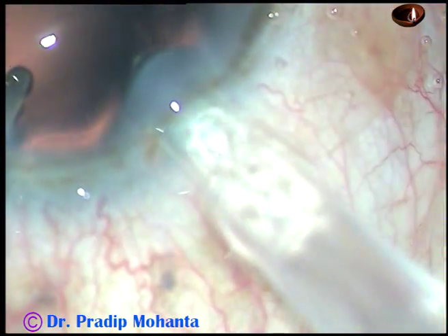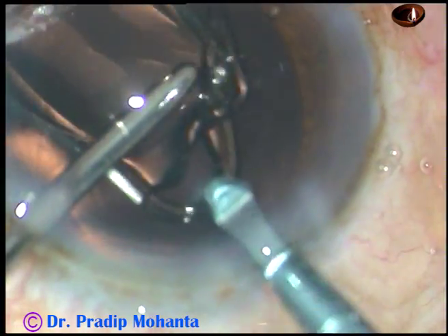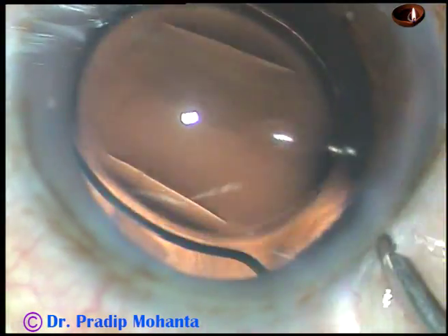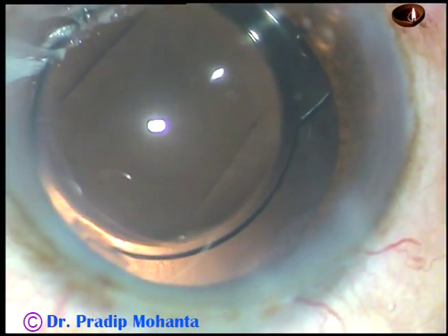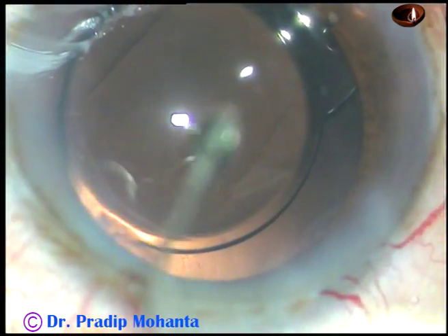Now the lens is being implanted under irrigation. The anterior chamber is kept formed by irrigating fluid, and this is a foldable hydrophilic intraocular lens being placed in the capsular bag. This hydro-implantation is a very good technique because you are not using viscoelastic substance, and the risk of raised intraocular pressure in the post-op period due to viscoelastic will be no more.